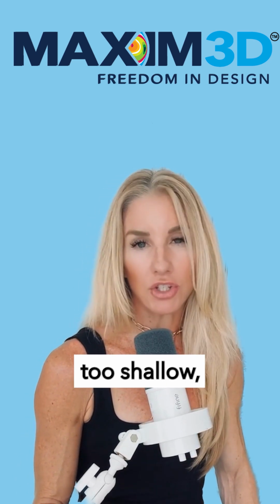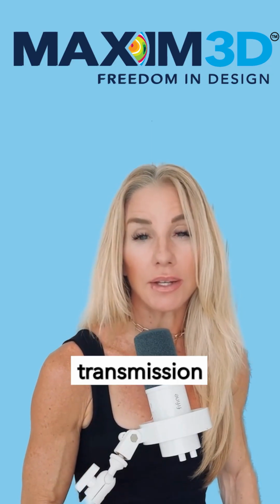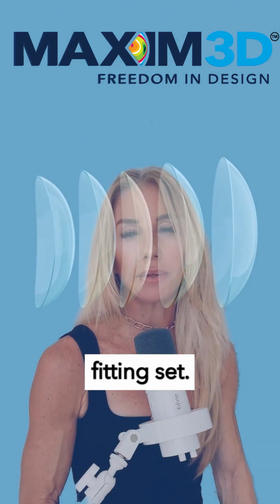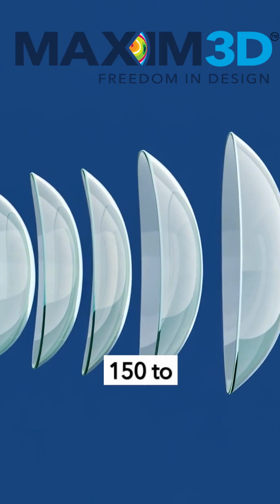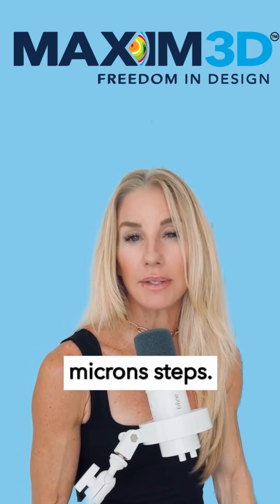If the lens is too shallow, you risk mechanical touch and corneal staining. If it is too deep, you may reduce oxygen transmission and increase fogging. Here is a fitting tip. If the clearance is off, move to the next lens in the fitting set. Each step increases sagittal depth by approximately 150 to 200 microns. For more nuanced changes, modify in 25 to 50 micron steps.